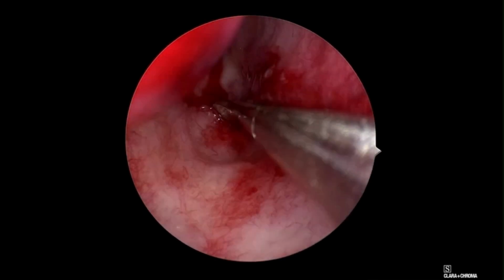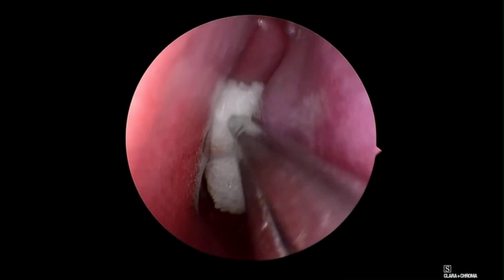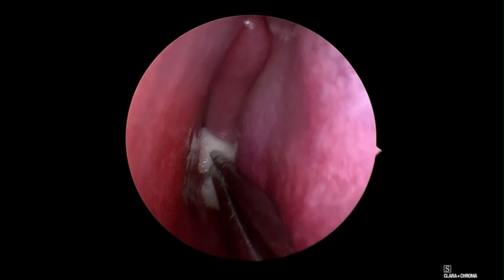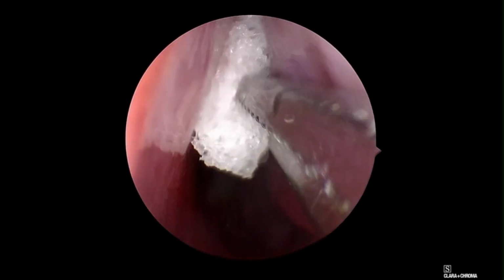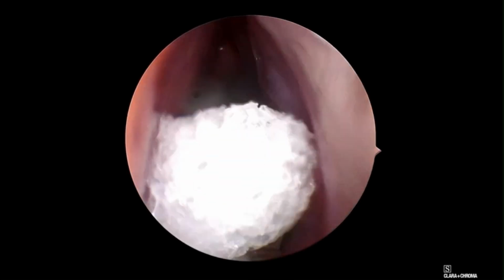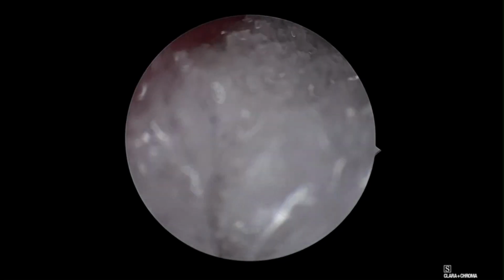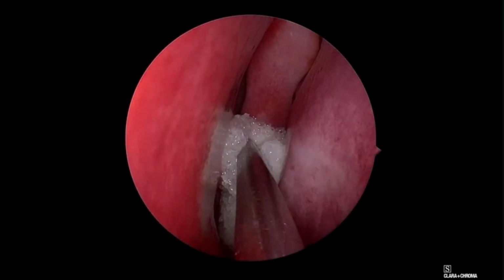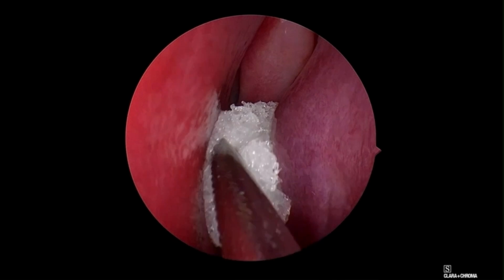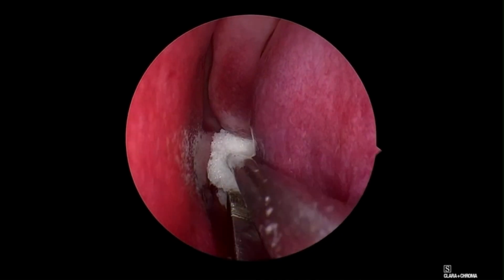First, I tried to confirm whether I could break the bony part of the choanal atresia, but it was very solid. So we proceeded with the nasal decongestion. Here I'm using a 4 endoscope, so nasal decongestion becomes very important in pediatric age groups.